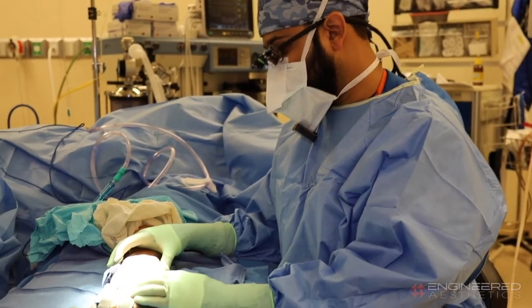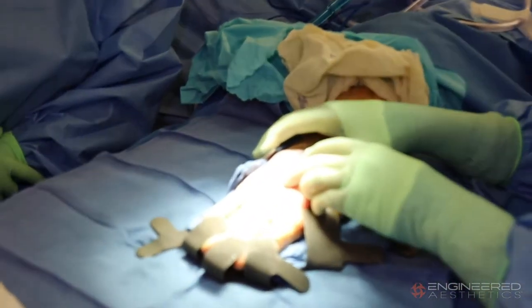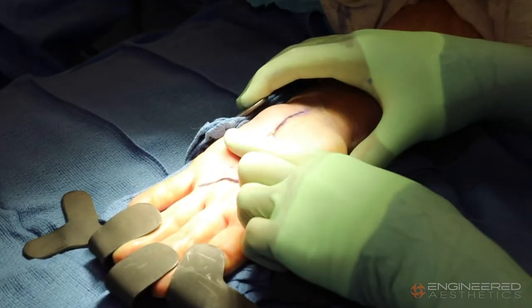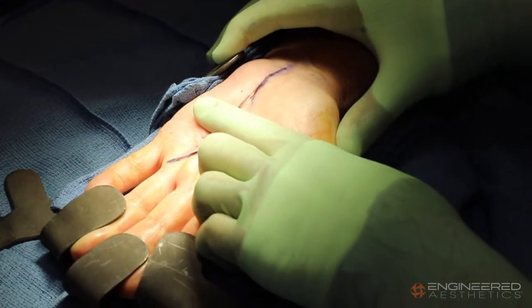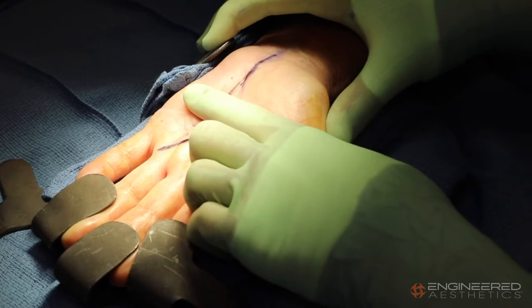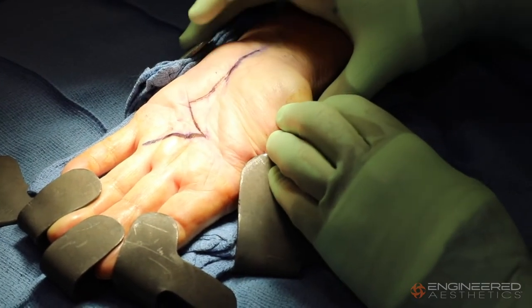You can see the incision that I planned out. The traditional open carpal tunnel release incision is a linear incision that goes to approximately the mid palm, and through that incision I can approach the carpal tunnel as well as Guyon's Canal.